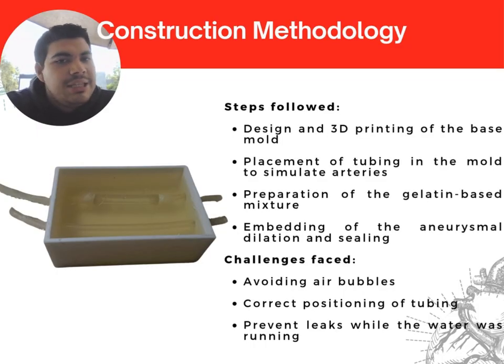We faced some challenges while building this phantom. First of all, we needed to avoid air bubbles. We needed to make the correct position of the tubing, and mainly we needed to prevent leaks while the water was running. The phantom couldn't have any leaks because of the ultrasound system. We needed to take care of that.